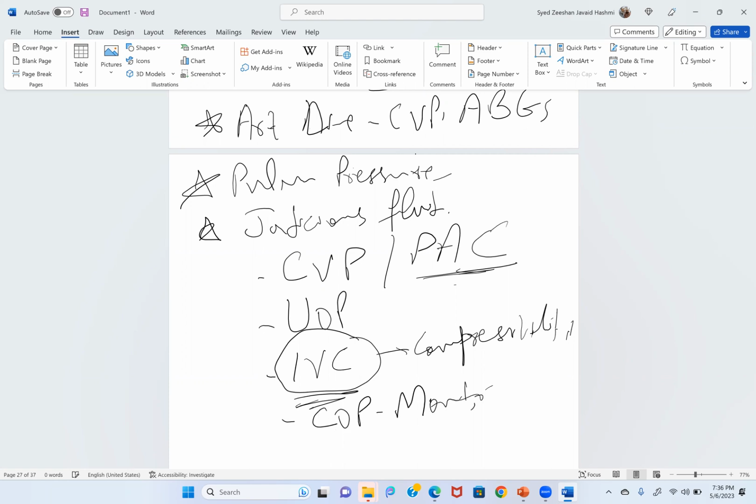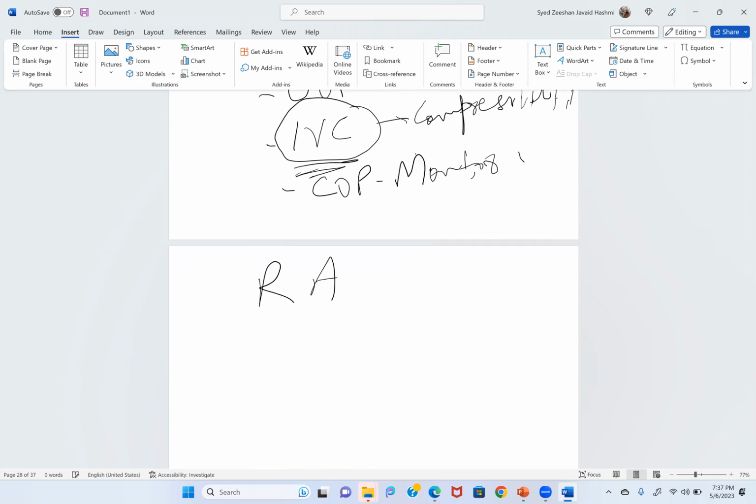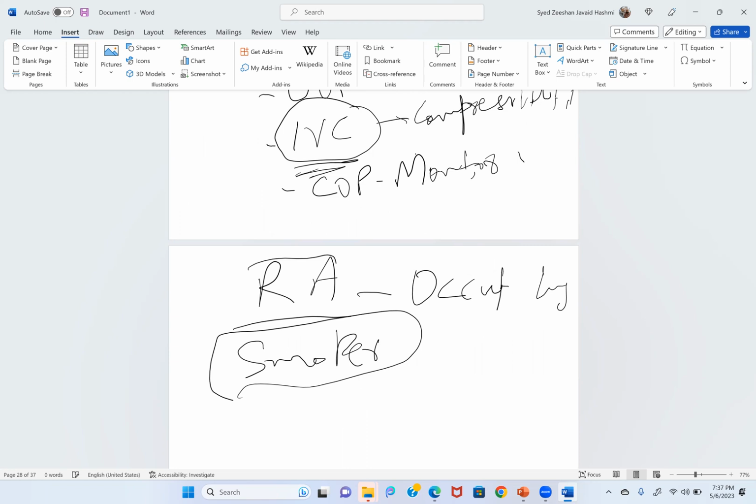In this scenario you will find patients with COPD, restrictive lung disease, for example a patient with rheumatoid arthritis or any occupational lung disease. I missed actually smoking. With a smoker, you see that there is some element of reversibility.